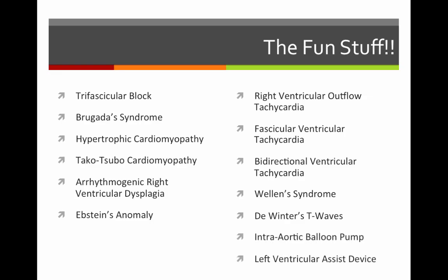And then lastly, we'll talk about a couple interesting things, not necessarily EKG wise, but things that you might see in the transport community, intra-aortic balloon pumps and their associated waveforms, and talk about that real quick. And then left ventricular assist devices, which you may have a patient in your jurisdiction, in your response area, that has an LVAD, and how to deal with them.